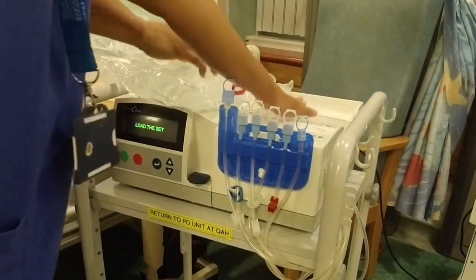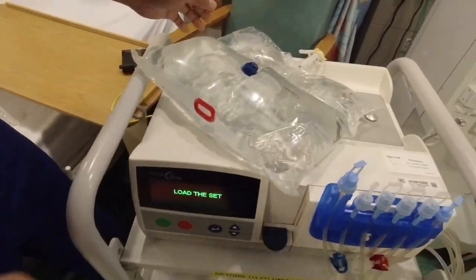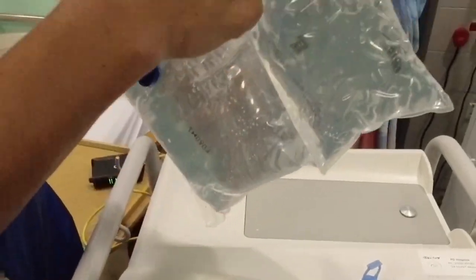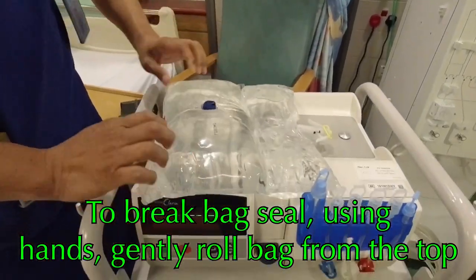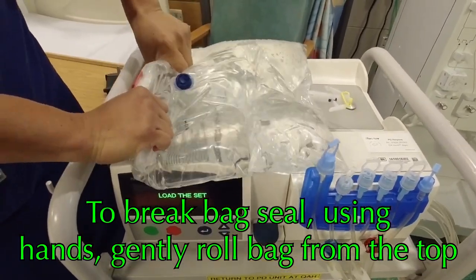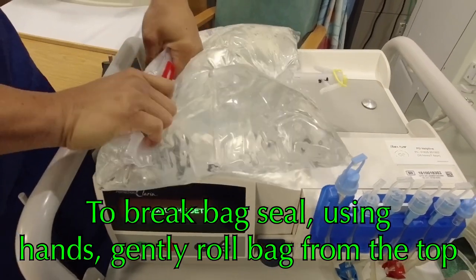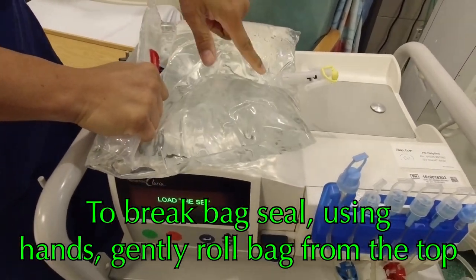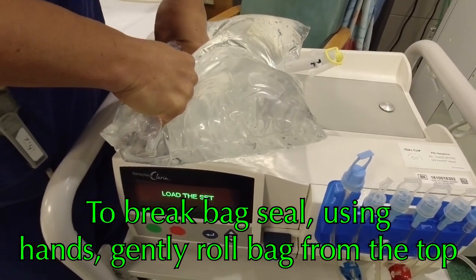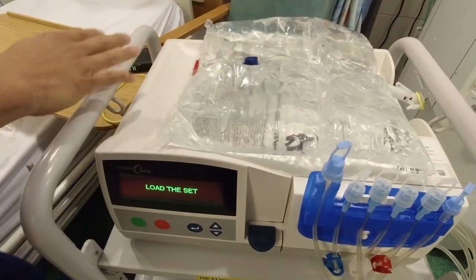This is the warmer. If you open the bag, there's a seal in there, a seal there and a seal in here. You just roll it from the top. There you go, it automatically opens. Then just slowly keep rolling, and we unseal now. You will break it. There you go. All broken.